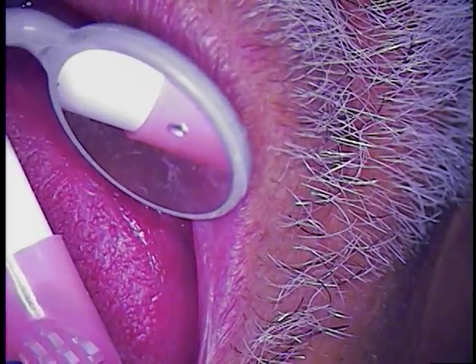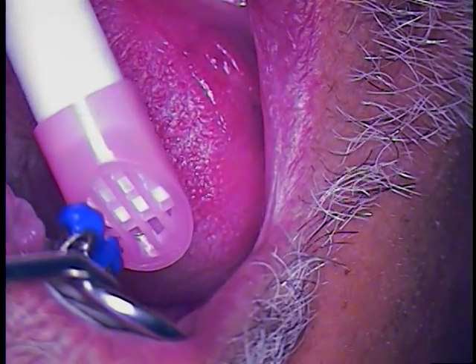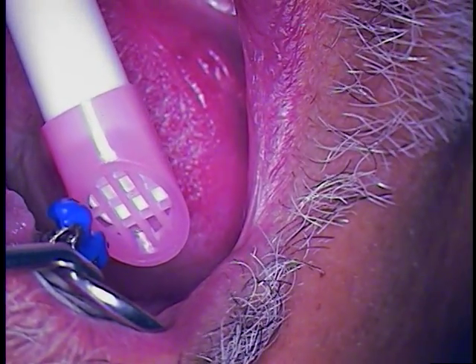and if this is not what we wanted, then we'll go back to using his original screw, and we'll just hand tighten. Basically, just hand tightening today. I'm going to switch it back to a lighter power. We'll come in more direct so that we can see the path of insertion.